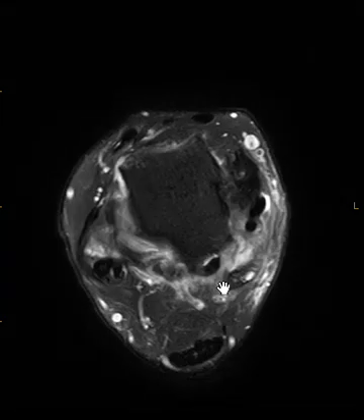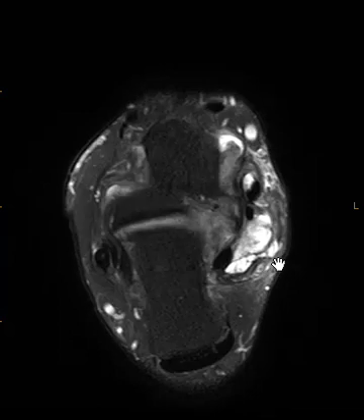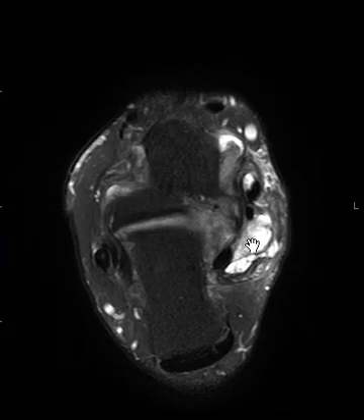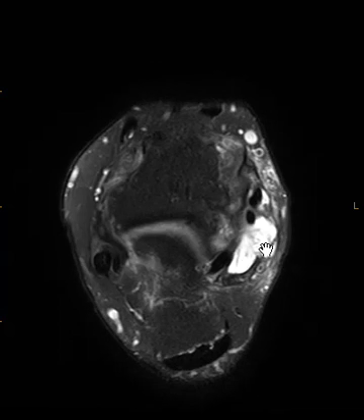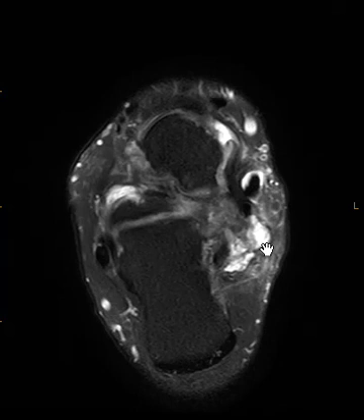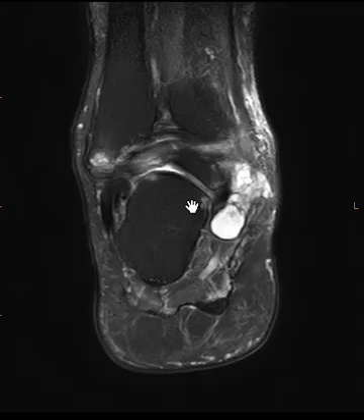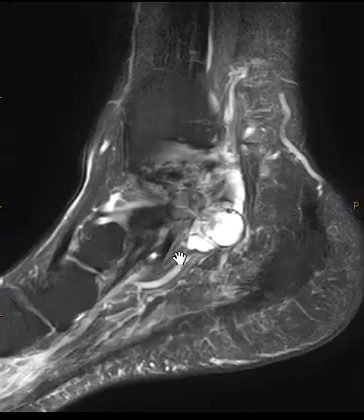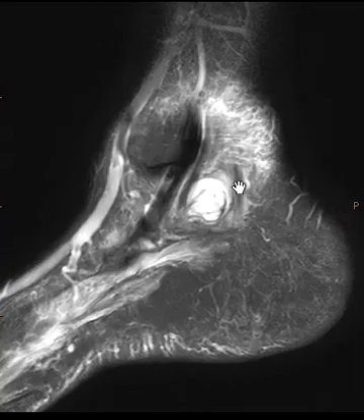In the T2-weighted sequences it looks pretty complex, with some cystic components — it almost looks like a really complex synovial cyst or a synovial neoplasm from that view.